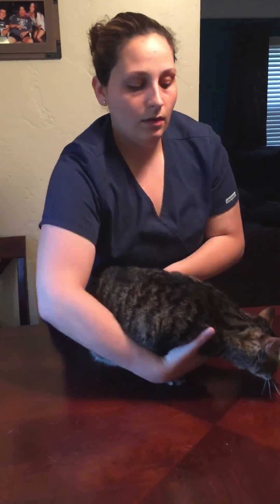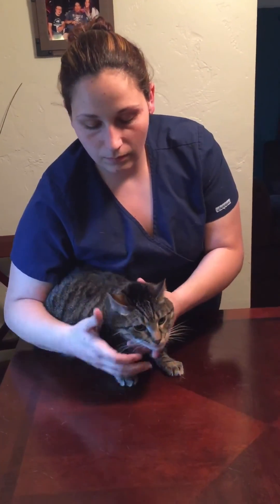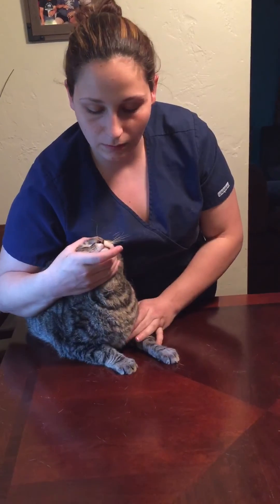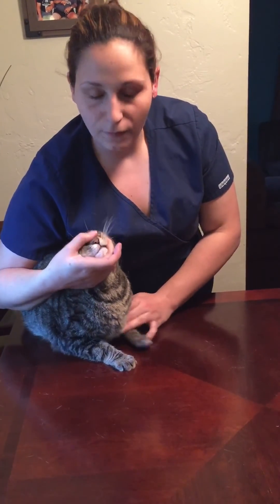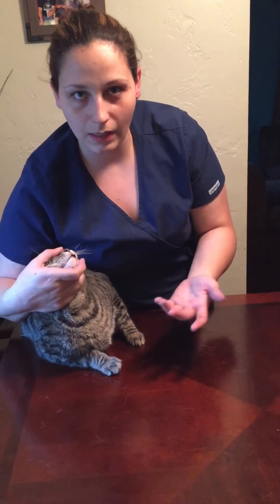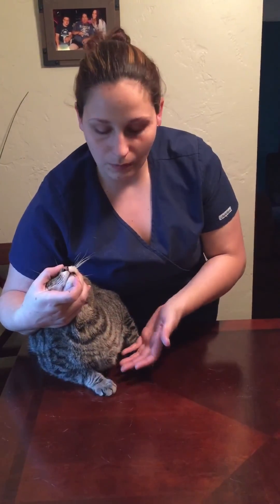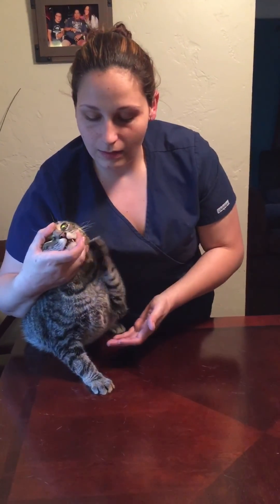The incorrect way to restrain for this procedure would be to just hold him by his muzzle, where your fingers can be bitten. He can back up into you and use his paws, he can even get away, and as you can see he's not going to be in an optimal position to stick a needle anywhere — he's going to bat you with his front paws.